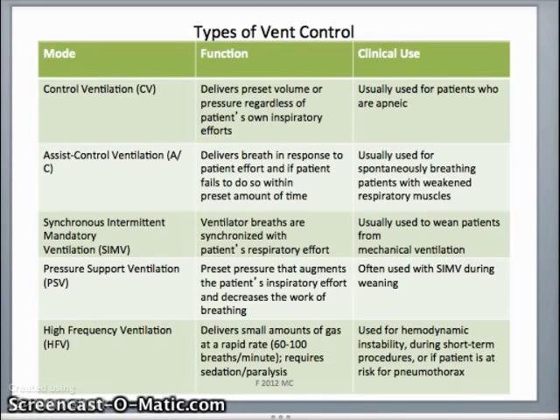okay, they'll only get maybe, I don't know, 300 milliliters of air, okay? If they take another bigger breath, let's say they move 500 milliliters of air, they'll get the 500 milliliters of air, okay?